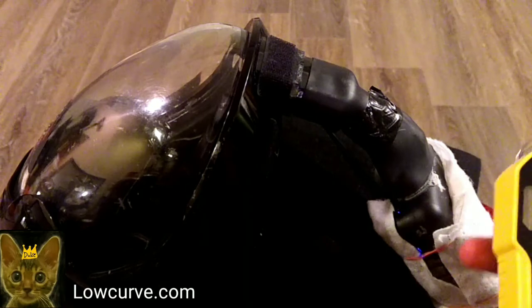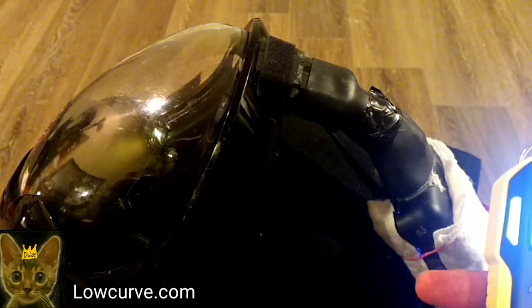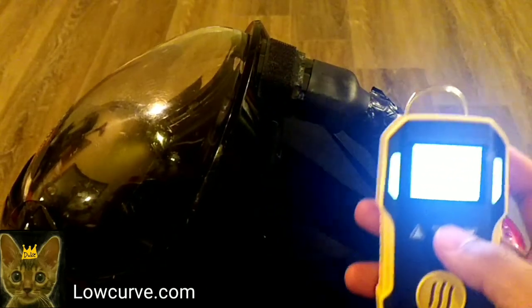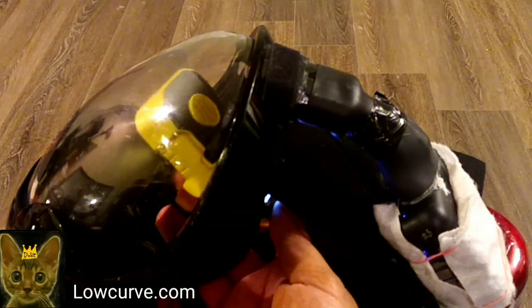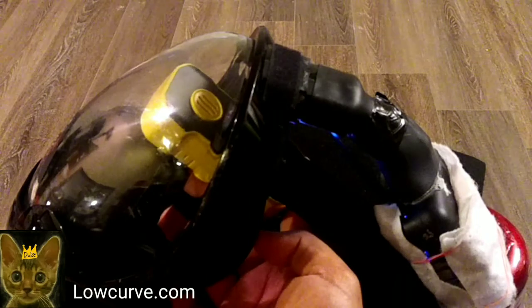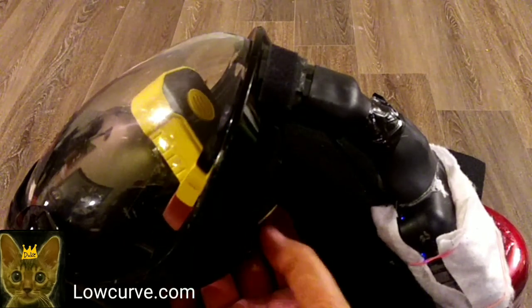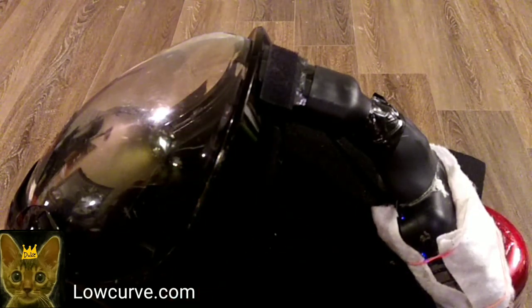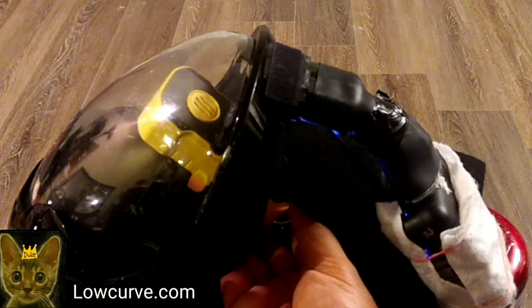And speaking of gas, I don't have very many ways to test the air quality, but here's a little carbon monoxide tester. I wish you could see the screen. It says 0 parts per million. So I'm putting this right here, and if it would go any higher than 0, it would beep. Okay? But it's not beeping. So there's definitely no carbon monoxide coming in through the air intake. Okay? There's no carbon monoxide coming in.